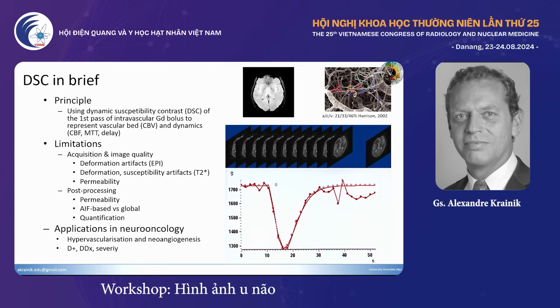And in brain tumor, we're not really interested in all the temporal parameters. We're mainly interested in the brain blood volume. Actually, how many vessels do you have in each voxel? Do you have a value in mind of the percentage of the brain parenchyma that is represented by blood vessels? How many percent of the parenchyma is blood vessel? Do you have an idea?